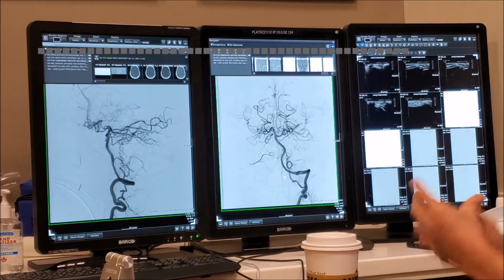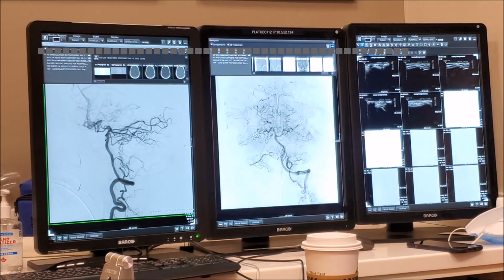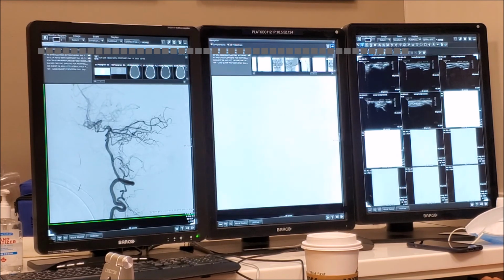Okay, same thing. Always try the circle of Willis, sort of. And this kid is really, right? Yeah, baby. Great case. I'm going to keep it in there because I'm going to look at it a little more. I'm trying now. We also need to figure out the meninges, which still haven't resolved.